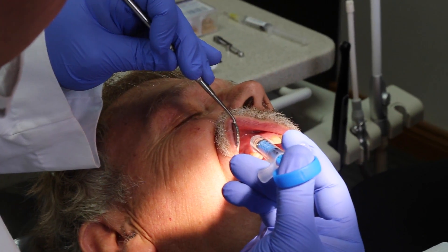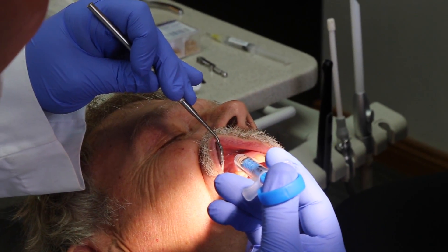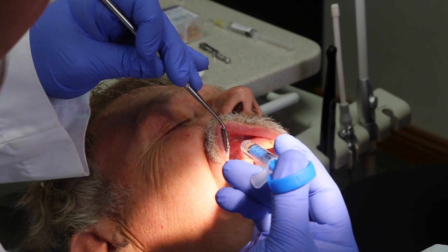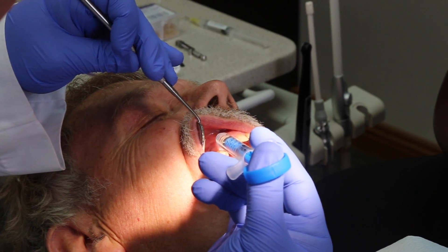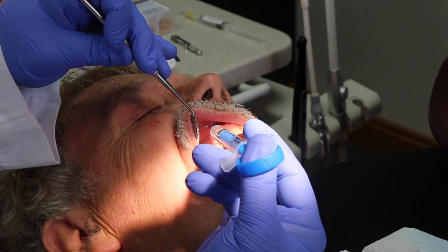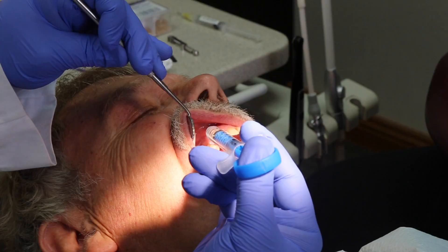As I'm doing this I'm thinking of just a drip, drip, drip delivery. We're not pushing — this isn't a volume game with the Nutri. It's about quality. It's about letting the medicine do the work and just delivering it to the apex of the tooth.